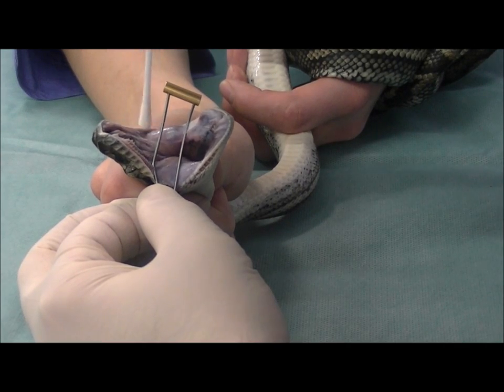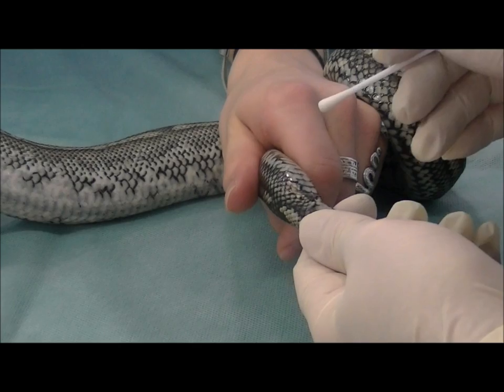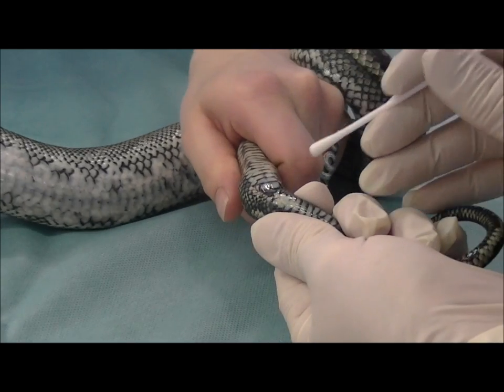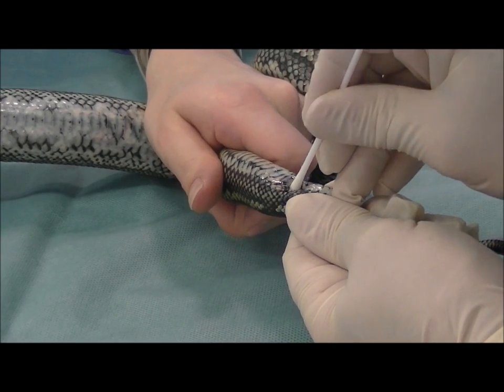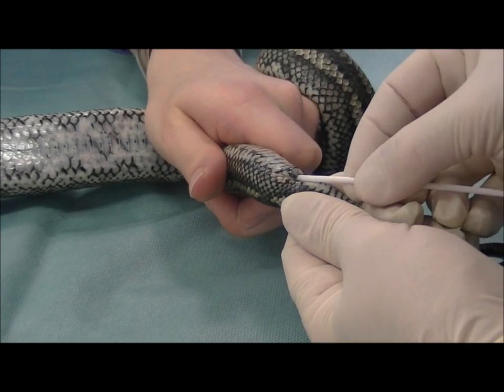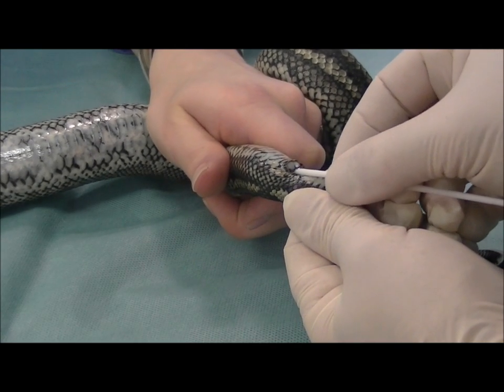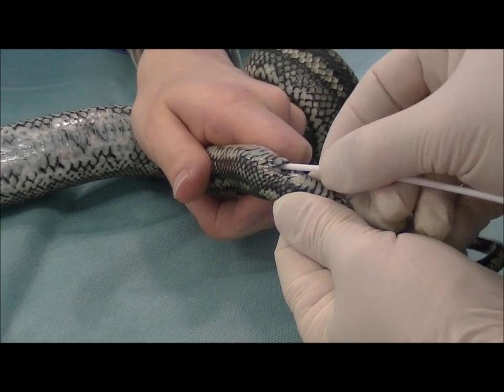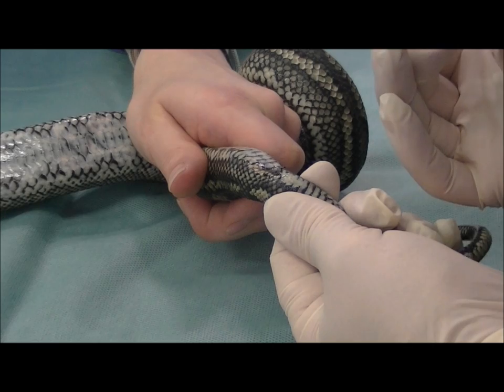Now we will show how to take a cloacal sample. We are using the same swab that we used in her mouth — you do the mouth first and then you go to the back end, not the other way around. It is pretty simple: we just lift up the cloacal scale and gently push the swab up the cloaca. It only needs to go in about one to three centimeters in a snake of this size. Just roll that around inside there so you are taking a sample inside the cloaca and up the colon, and then you can remove it.